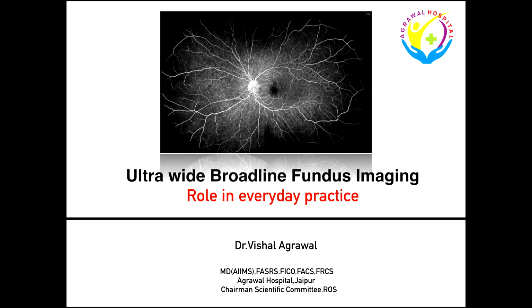Thank you, everybody, and good morning. I'll be speaking on the role of ultra-wide imaging in everyday practice, and specifically, I'll be using my experience in this presentation of the broadline fundus imaging, which I use regularly.